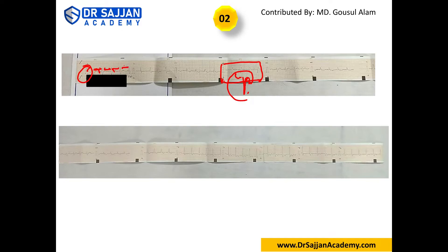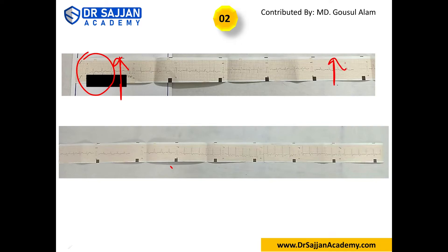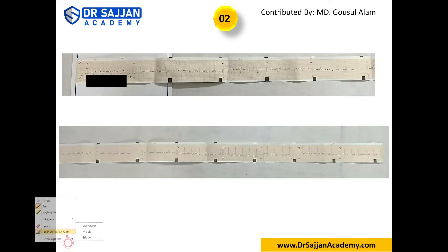Rate: we cannot calculate exactly, but it looks like around four boxes, and three to five boxes is normal, so rate is normal. Axis: in lead one it's going up, and lead AVF it's going up — so the axis is normal.